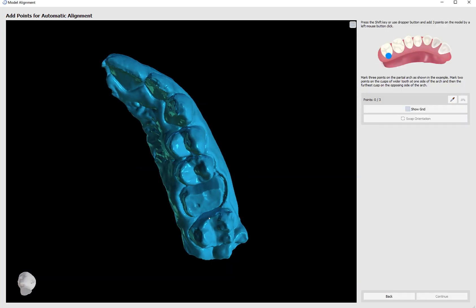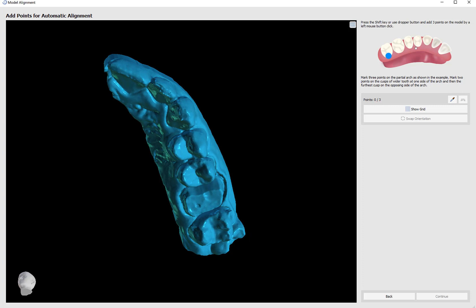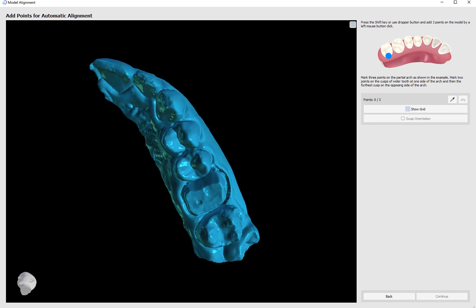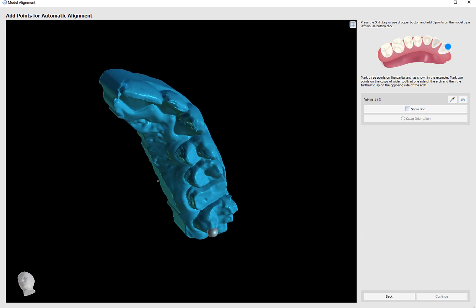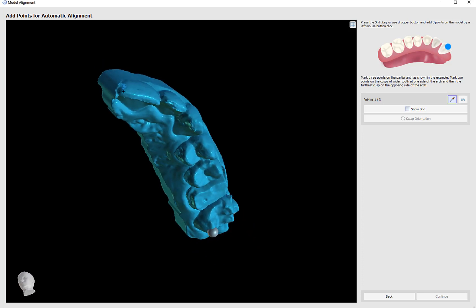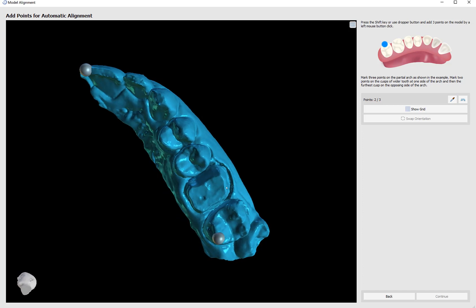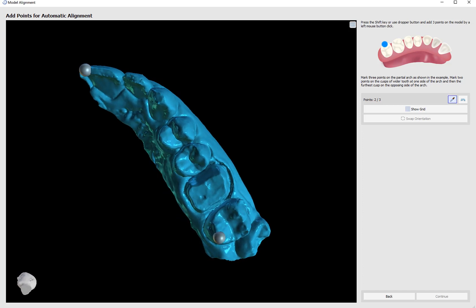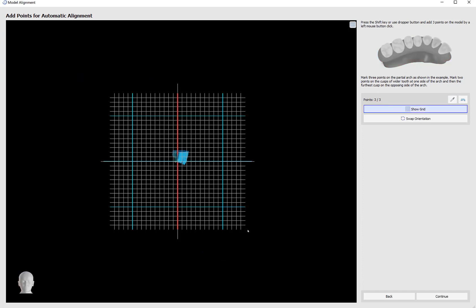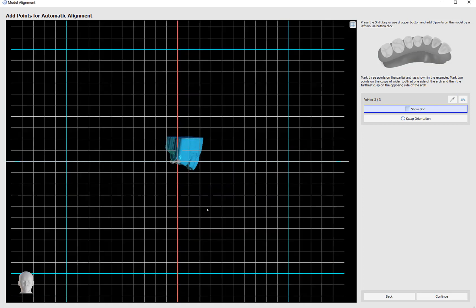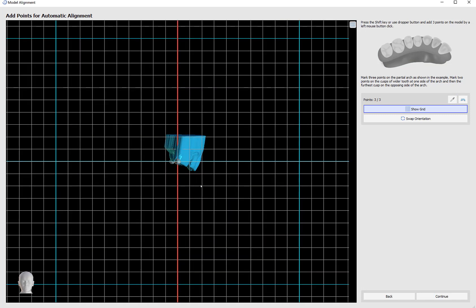To align the models correctly, I'm going to follow the diagram in the top right. Hold down the shift key and left-click on one of the cusps on the lingual side. Mark the second point with the shift key and left-click as close to the mesial of the model as possible. Mark the third point again towards the back on one of the buccal cusps. The software now automatically aligns the model to the grid.